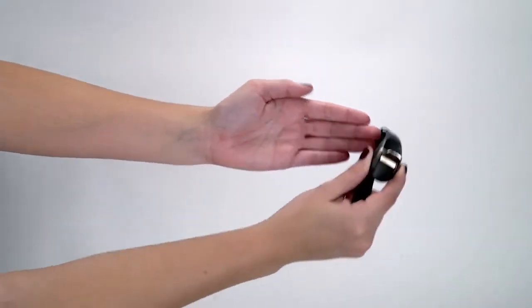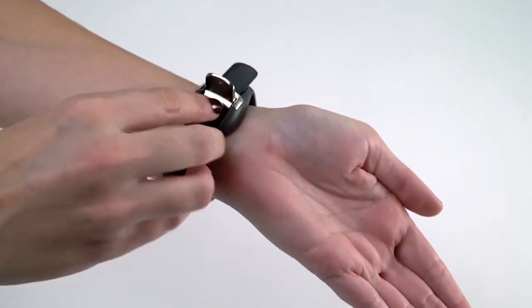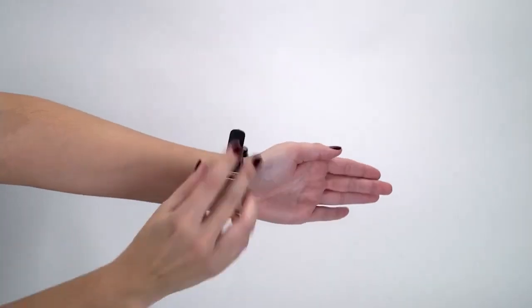Hold the Relief Band by the clasp and place the contact pads onto the gel you just added to the underside of your wrist. Then fasten the device snugly.